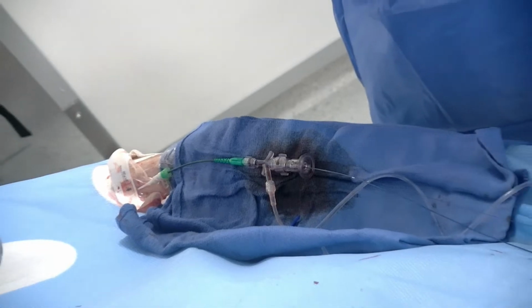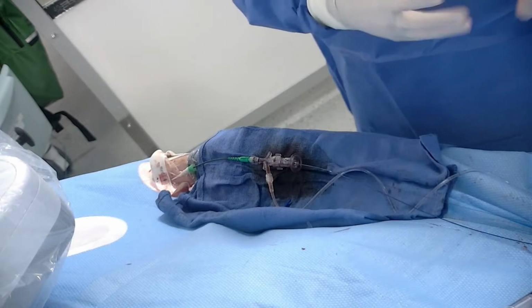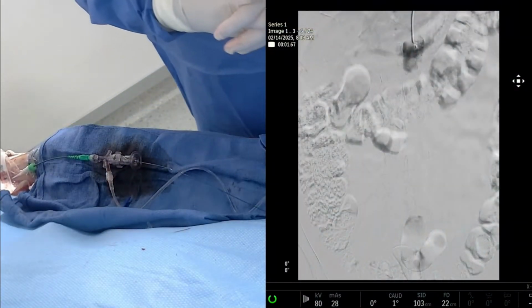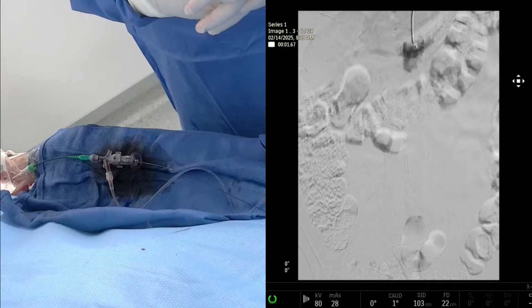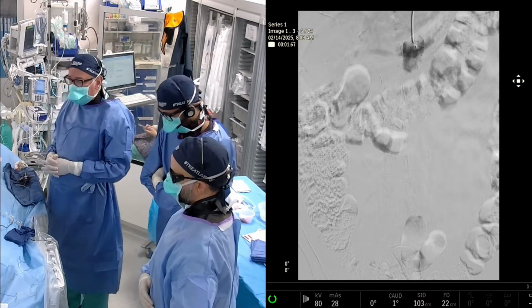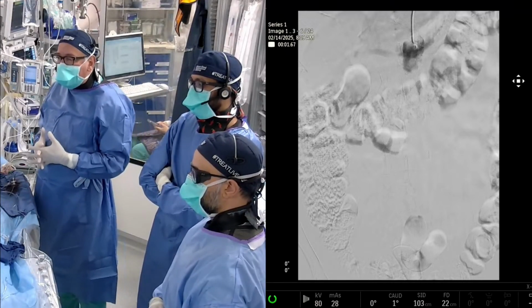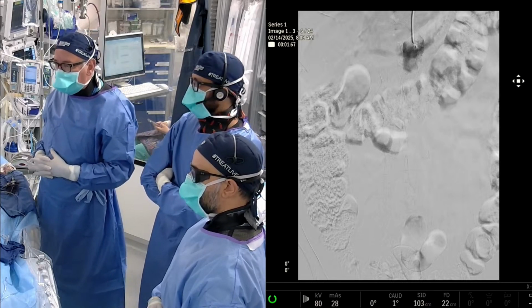Before we start to sort of get you up to speed on what we've done so far, just from my summary point of view, we have a patient with a large vessel vasculitis involving the entire infrarenal aorta. It's manifesting itself as a significant inflammatory occlusive disease of several renal arteries that's clinically manifesting as refractory hypertension. He has severe disease in both of his iliac arteries, and while he's subjectively mildly claudicating, he says he's not able to do what he normally does in the gym. That's not his primary concern right now.